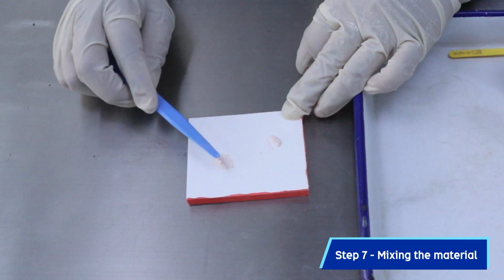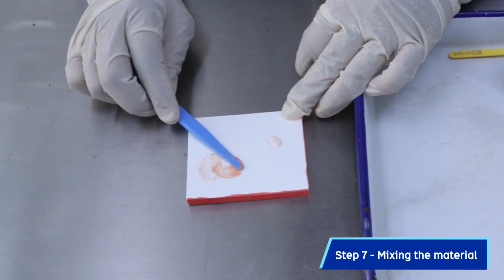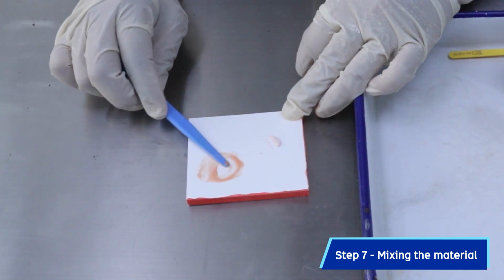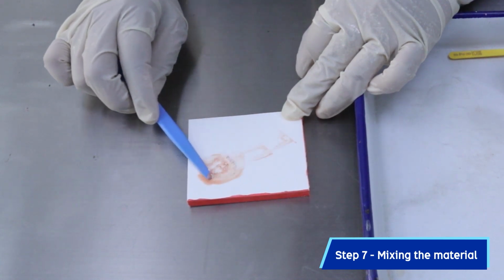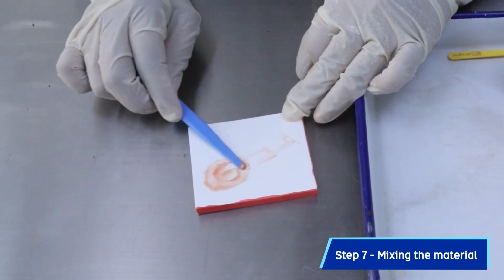Spread the liquid over the pad. Mix the first portion of powder with liquid for 10 seconds. Incorporate the remaining portion and mix for 10 to 15 seconds. Total working time for 1 level yellow scoop would be 1 to 2 minutes.